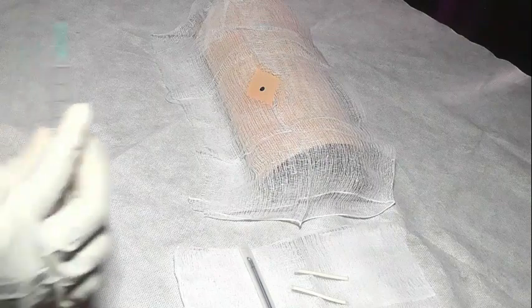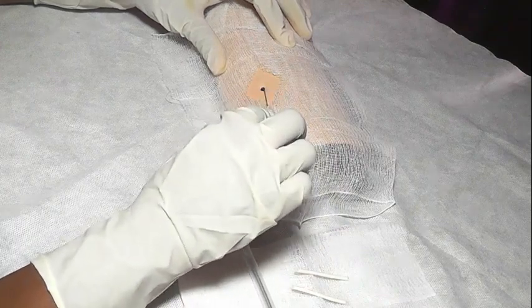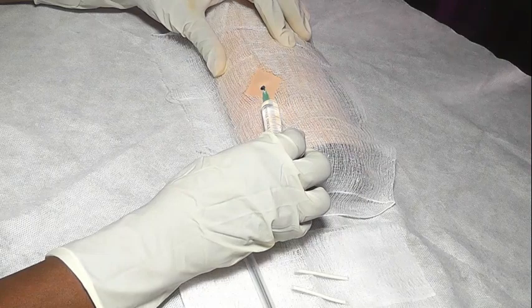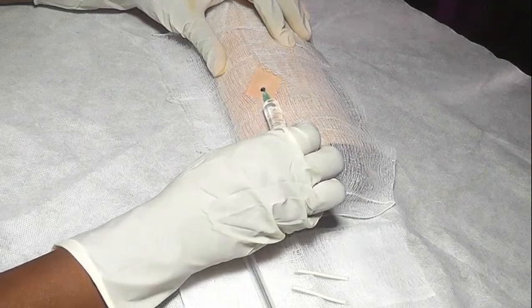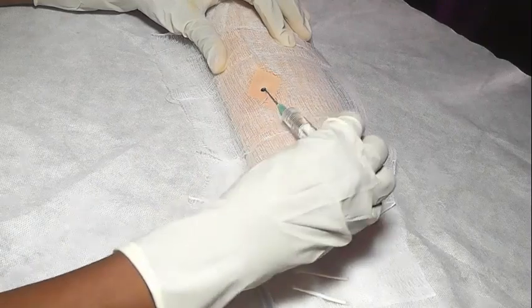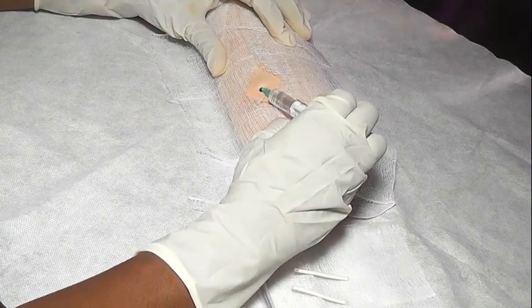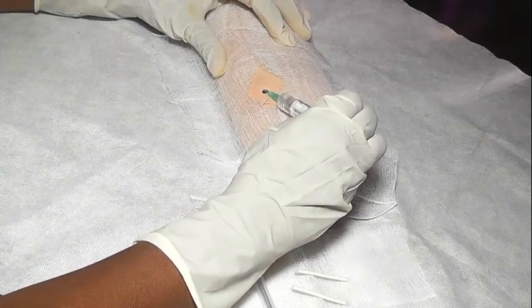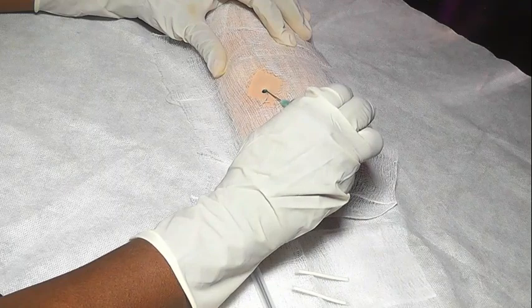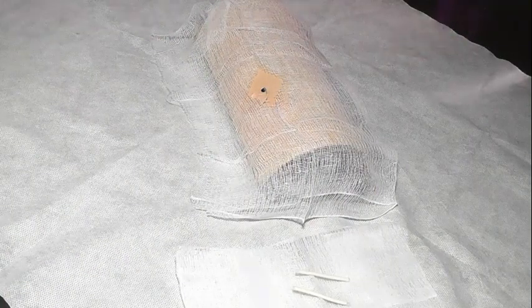anesthetize the area. So since it is subdermal, you're going to introduce your needle at the site where you want to insert the Jadelle. So you go down and then you introduce. Then as you're coming out, you are also introducing the xylocaine. I'm going this direction because I'm going to place the rods in a V direction. So I'm coming out, I'm introducing the xylocaine injection. Before it comes out, you make sure you introduce all of it. Then you discard in the injection box.